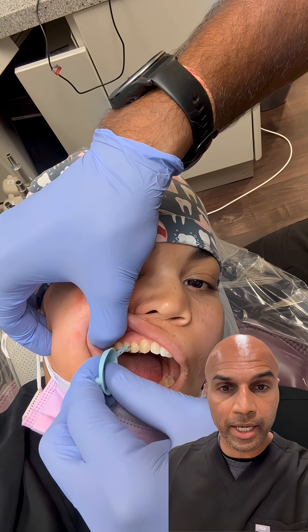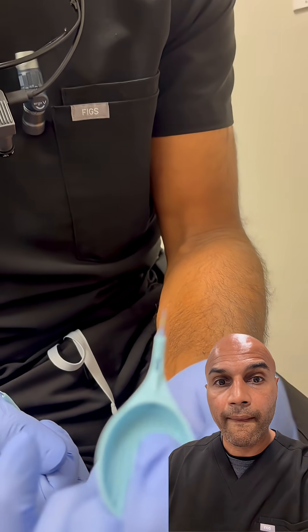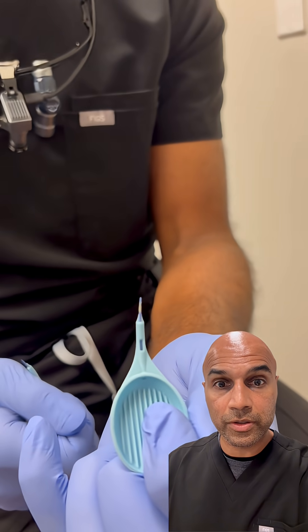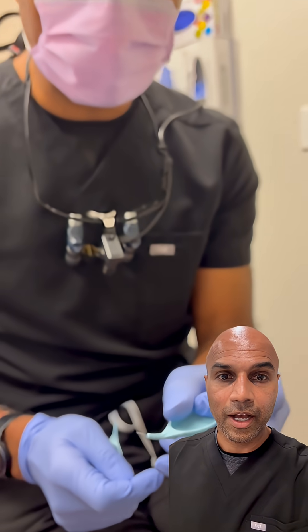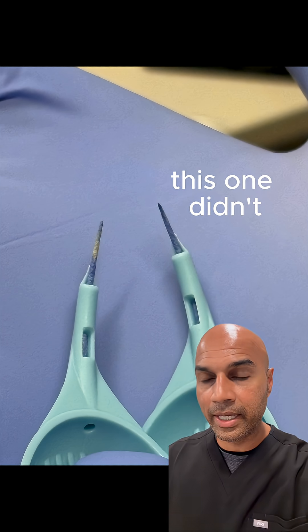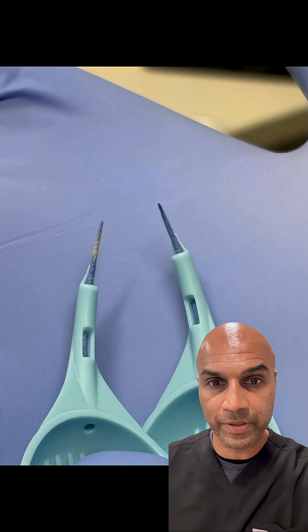So in an area where there's no decay and no cariogenic bacteria, the toothpick is going to stay the same color. In an area where there's still bacteria, the toothpick is going to turn yellow, and that means you have to continue to intervene — you still have to be worried about that area. It's a really nice objective way to see if non-invasive means are actually working. It's called CaviSense.